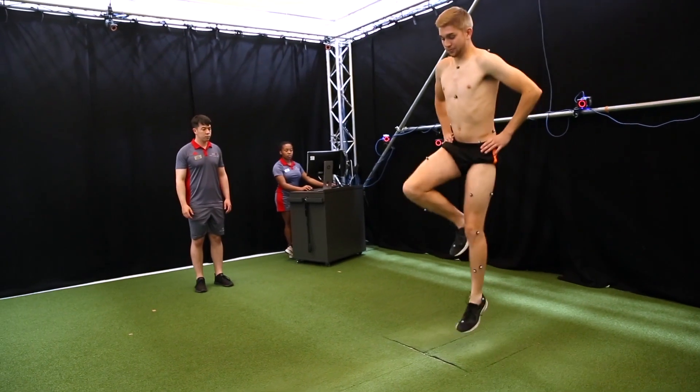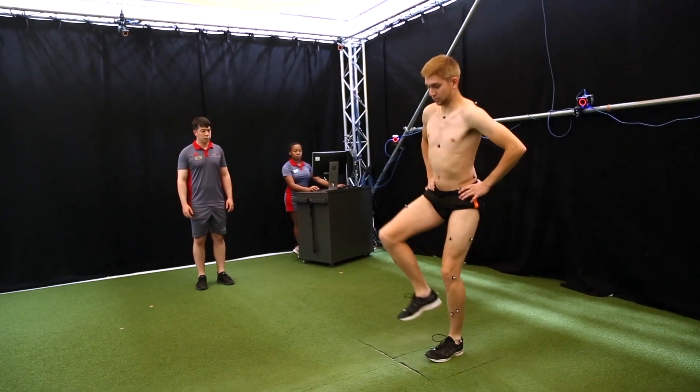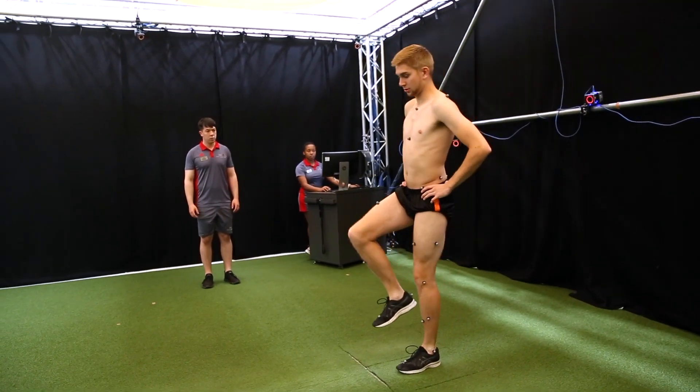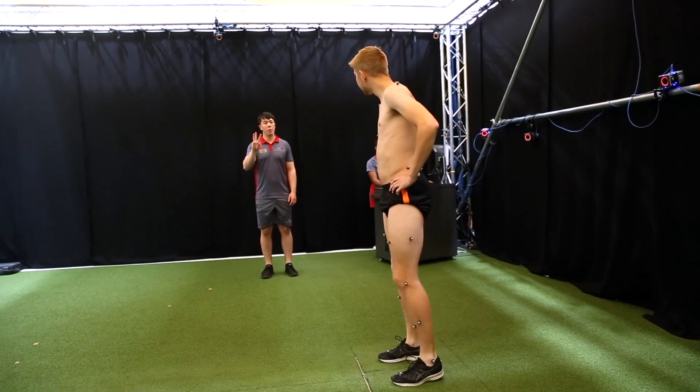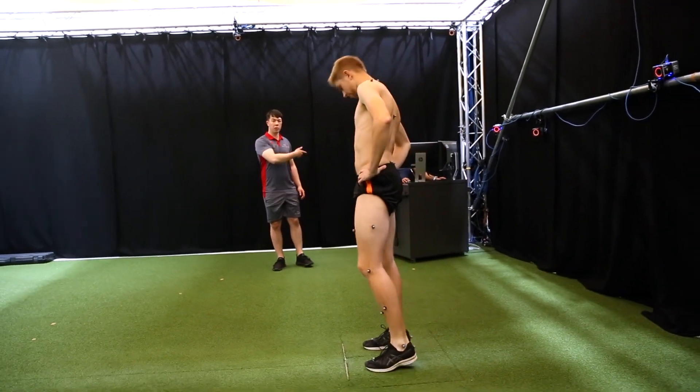All of our consultations now occur around the central hub where we have three Vicon laboratories — two really based on lower limb change of direction and one based on upper limb assessment.